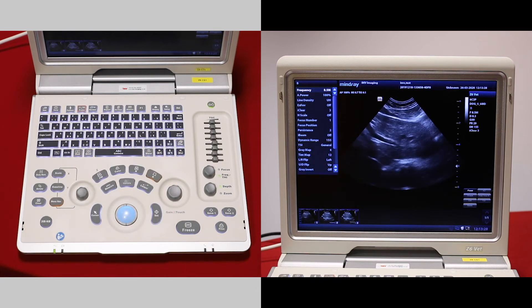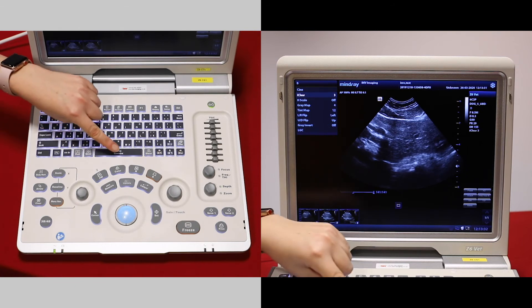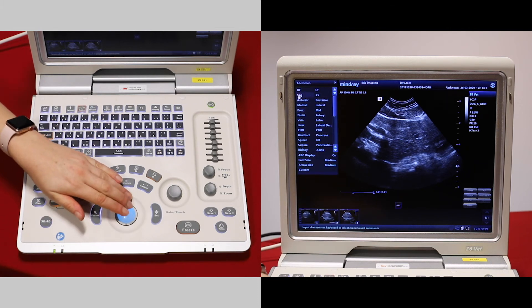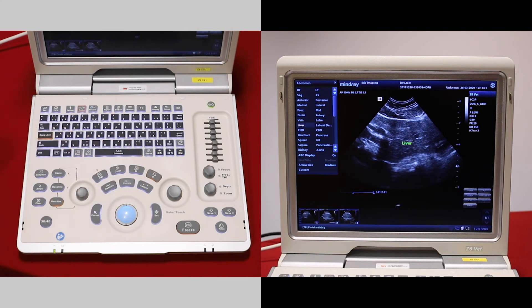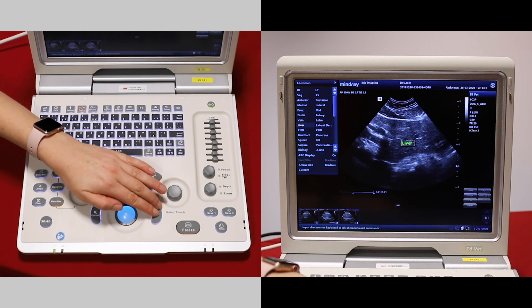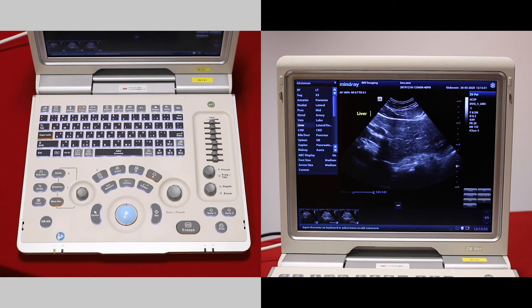If you would like to put an annotation on rather than a measurement, freeze and then the spacebar is the comment button. Press this to bring up a list of abdominal words because we're in the abdominal preset. Select the one you like — you can then hover over it with your trackball, press set to pick it up and move it, and set to put it in place.